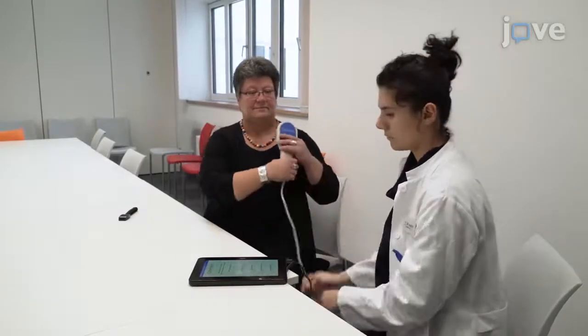Demonstrating the procedure will be Dr. Merve Aydin, a clinician from the Department of Psychiatry and Psychotherapy from the University of Bonn in Germany.